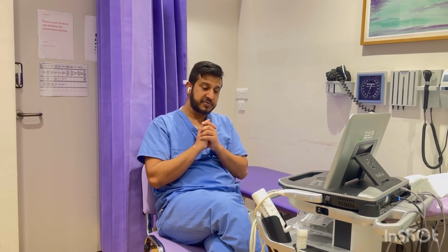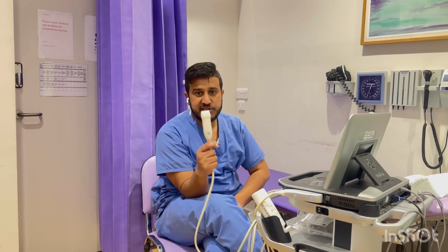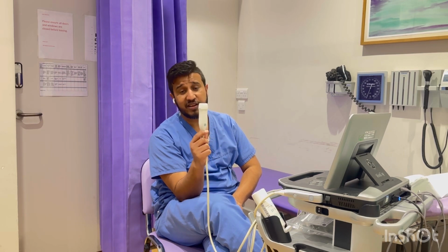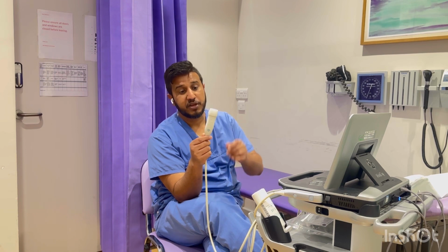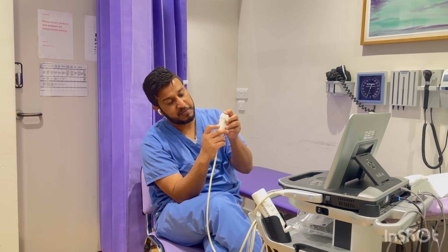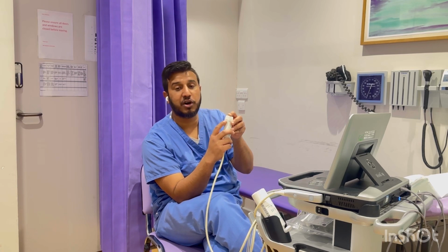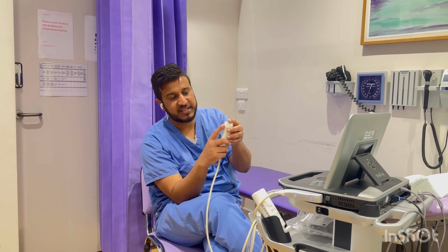So these are the main images, main windows. I'll explain slightly about the probe as well. This is the probe which you use for the echo imaging. It has its parts, which will help you during the imaging. If you look at this one, in every probe either there will be a light here or there will be a mark here. Someone calls it the marker, someone calls it the eye of the probe. Whatever you call it, this is the main thing.